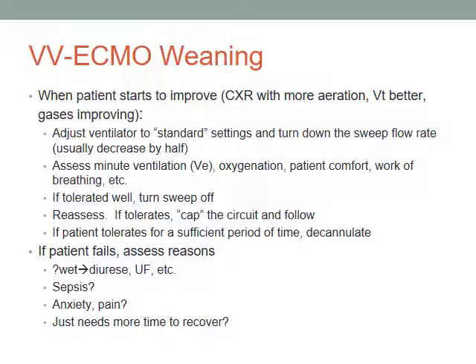This is basically weaning. Some patients pass on their first attempt, and others after about a month. It just depends. If a patient fails, try to assess what the reasons are. Are they wet? Do they need to be diuresed? Do they need filtration? Are they septic? Is it anxiety or pain? Or is it just that the lungs are sick and it takes a long time to recover? That's often the answer, but there may be another mechanism.